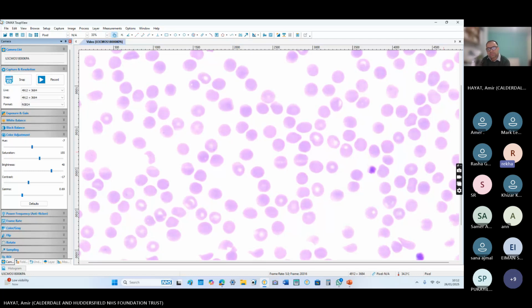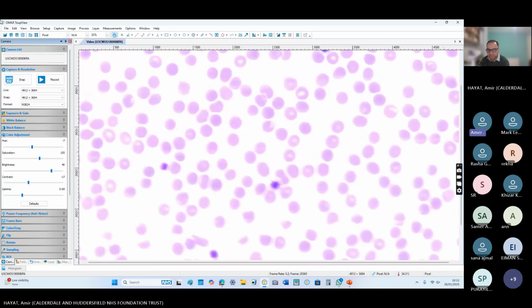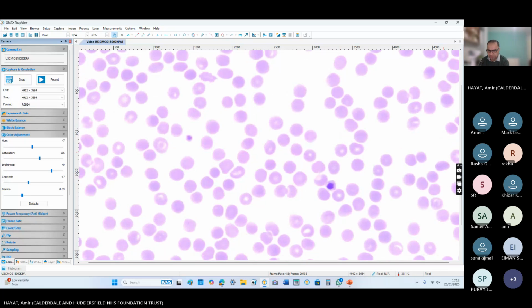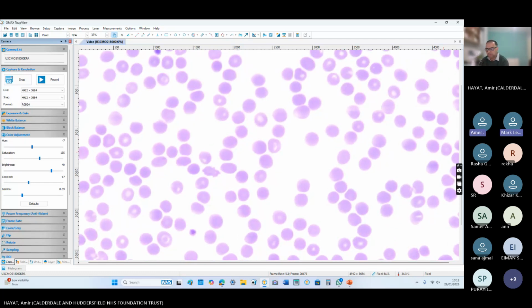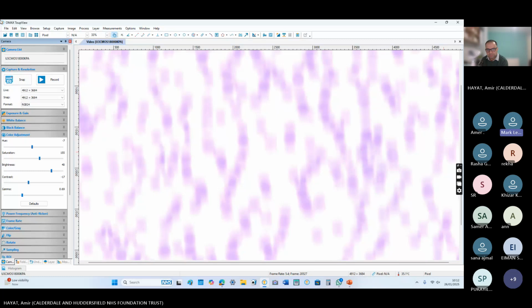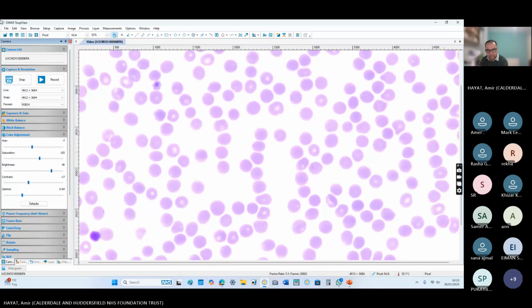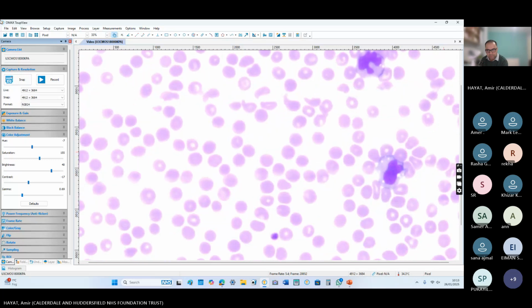You have a 7-year-old child with recurrent epistaxis, and the lab scientist says that this patient has thrombocytopenia. So nucleated RBC there. So you are from the lab side, okay? We need your comments first before referring this to clinical hematology. Well, it's the thrombocytopenia that, the age of the child, is concerned. I'm looking for blasts, but I can't see any. These are reactive.